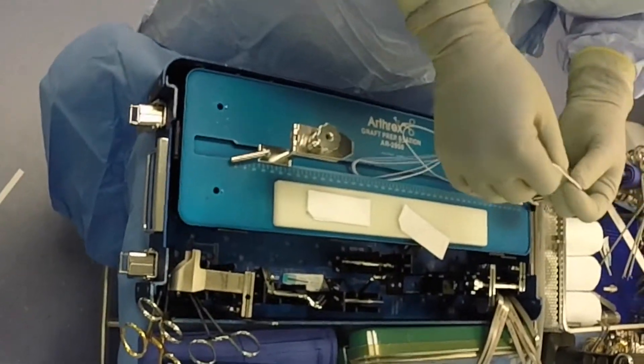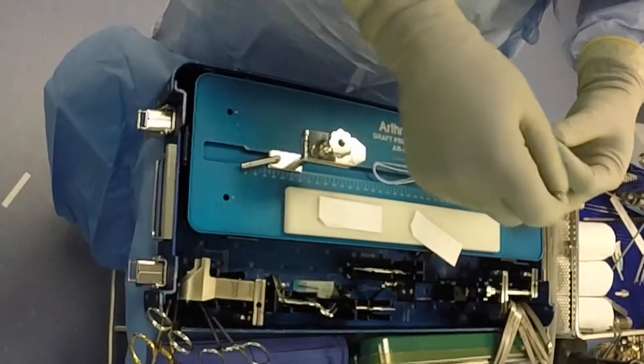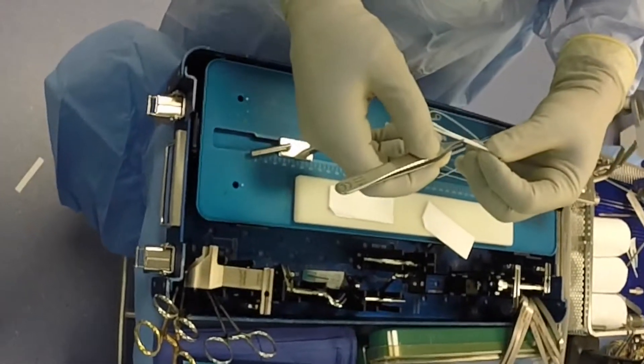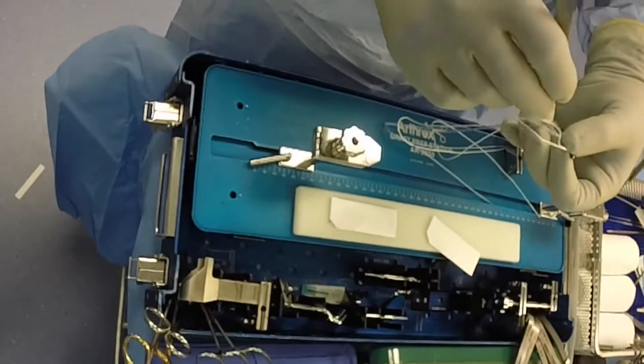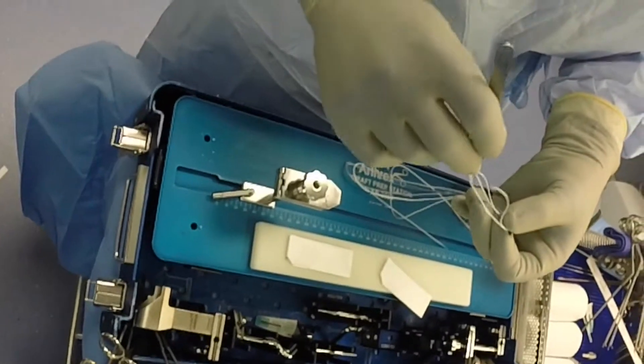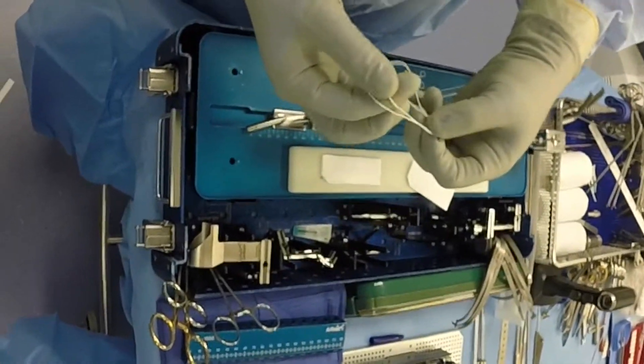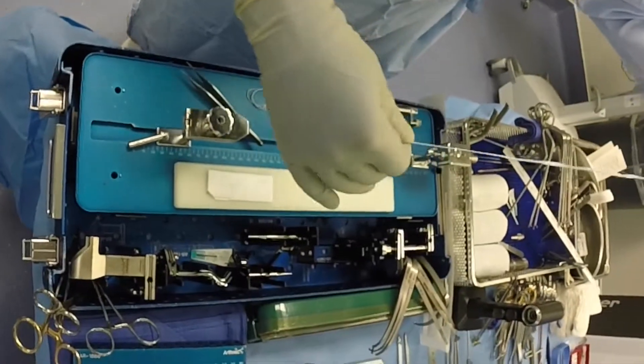The graft preparation begins by lengthening the TightRope RT fixation device loops to make it easier for graft passage. Once the first TightRope is lengthened, a FiberTape suture is secured.